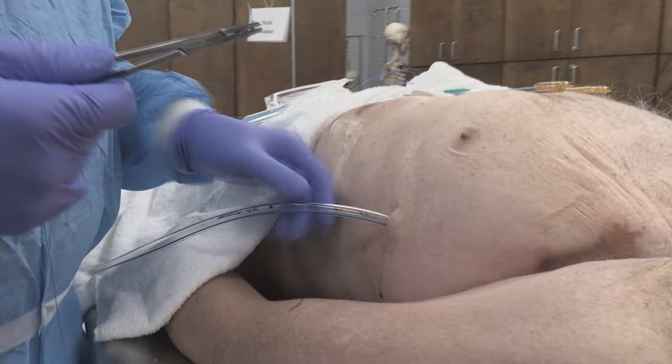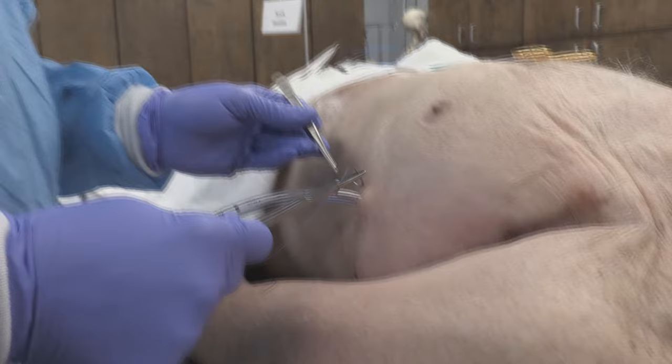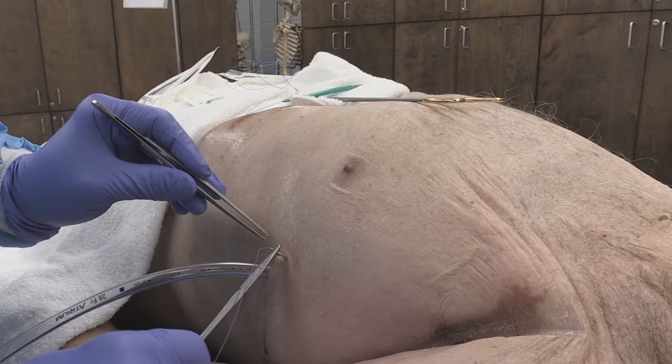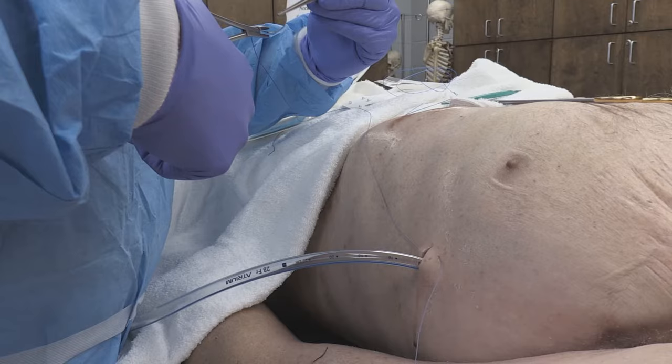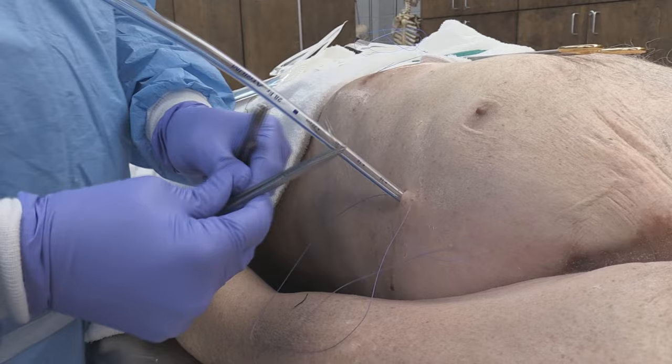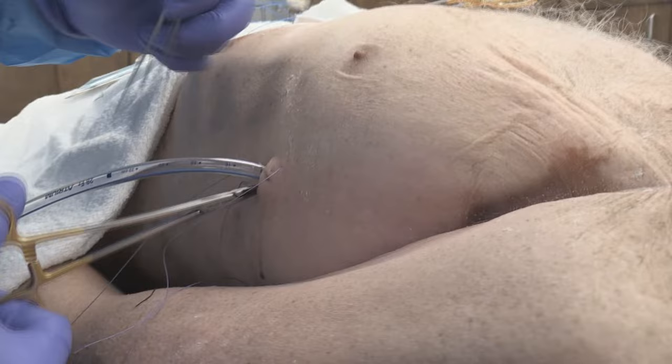It's a fairly simple tie, and it secures the chest drain very well. To walk you through the principle of securing the chest tube, it's basically a purse string. We're just going to come in on one side, and then I'm going to loop it around underneath the chest tube to form a purse string. Once I've done this, I've got my purse string.